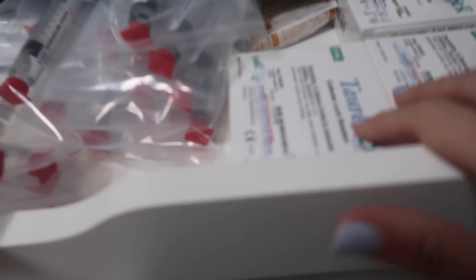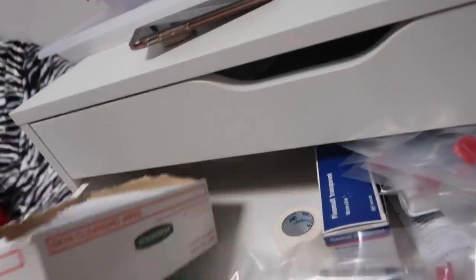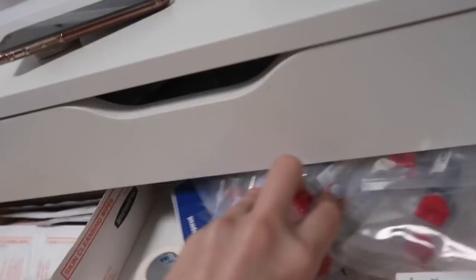So this is what my drawer currently looks like - we have a bunch of Taurolock here that can be drawn up by hand, but these syringes are already measured out to the amount I need. So I'm just going to pop this in there. The next thing which also goes in the same drawer as the Taurolock is my Tegaderm. This normally sits at the front, but I'm just going to move it out of the way and the Tegaderm sits behind that one at the back.